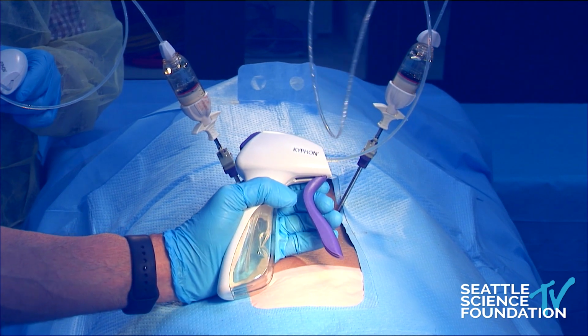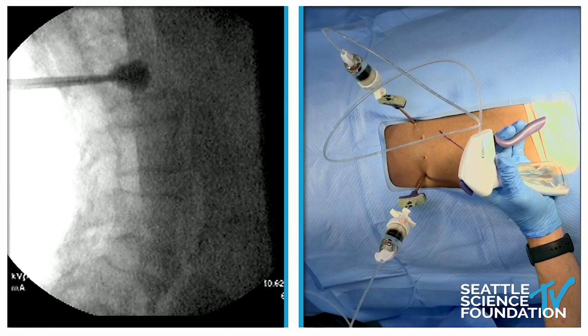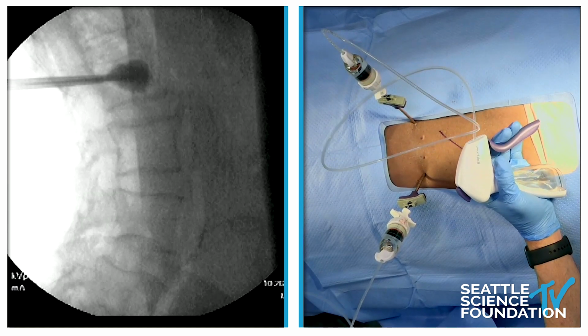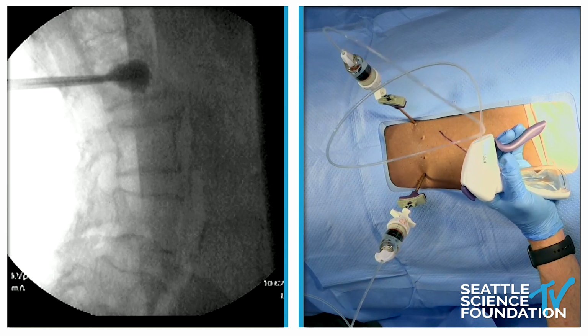So we'll take a look lateral, and we're going to inject a little bit more cement in, because more is better in almost everything in life, except for taxes.